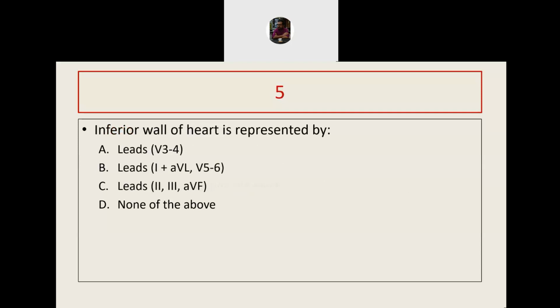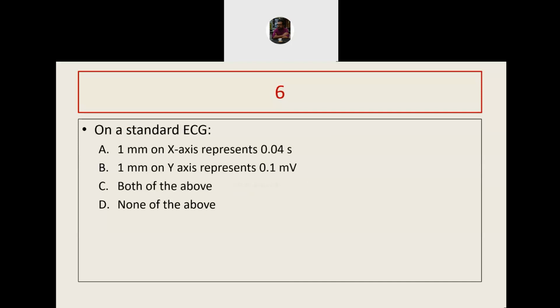Next one is: inferior wall of the heart is represented by? Next question. On a standard ECG, which one is true?